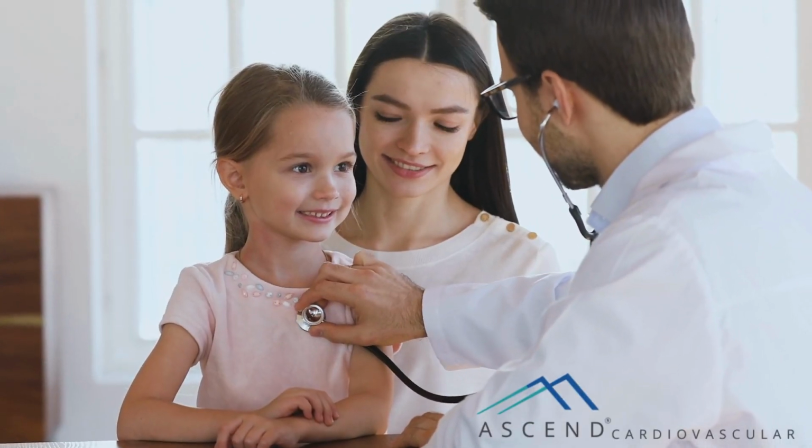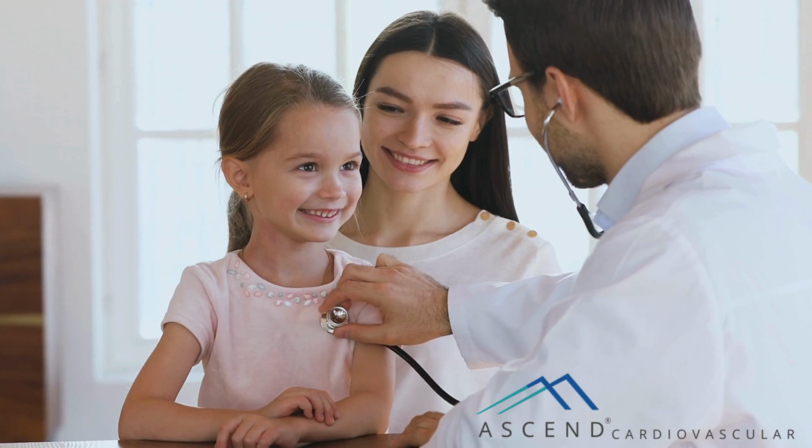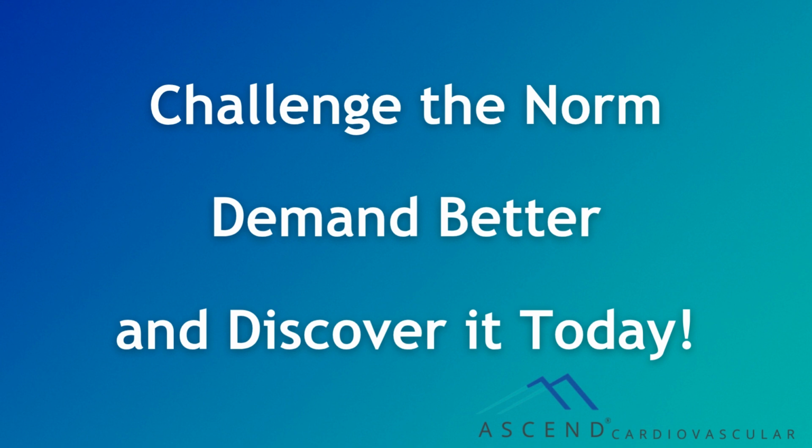Stop settling for outdated tools. The future of pediatric Cath reporting is here, and it's going to change everything. Challenge the norm, demand better, and discover it today.